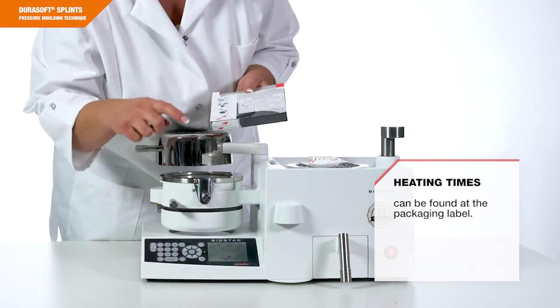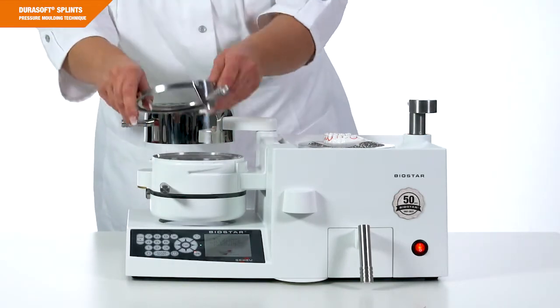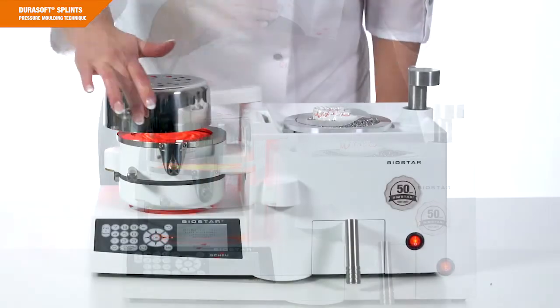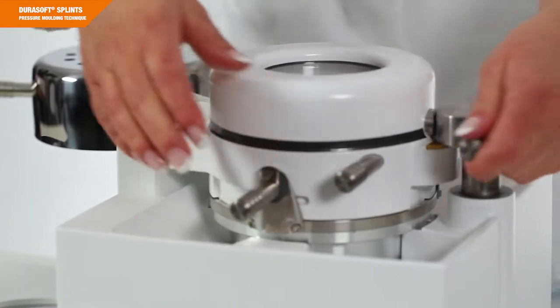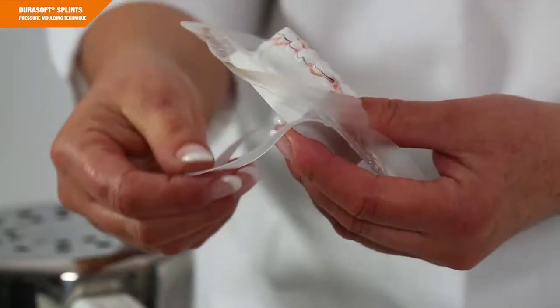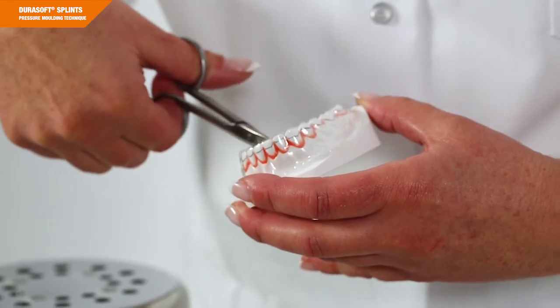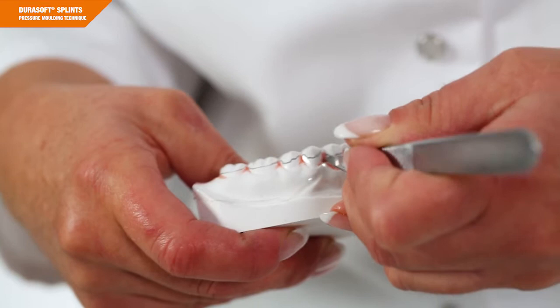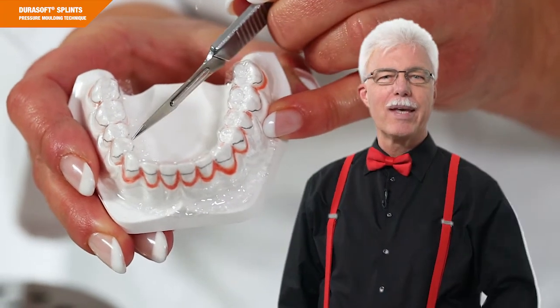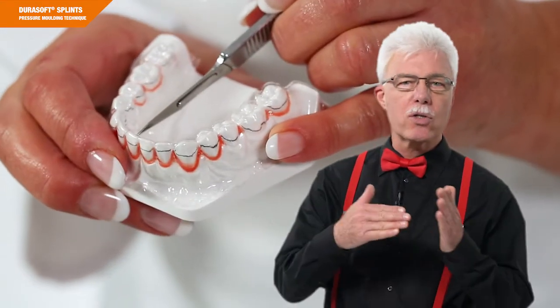Enter the heating time indicated on the packaging label and fix the DuraSoft seal material. Start the heating process. Once heating is completed, flip the DuraSoft seal over the model and close the pressure chamber. Reduce the DuraSoft seal foil, taking into account the desired splint extension using SD foil scissors. Perforate the area below the interdental papillae with a scalpel. Very important: always make sure not to make any incisions to the splint extension, as this might impair the protective effect of the DuraSoft seal foil.